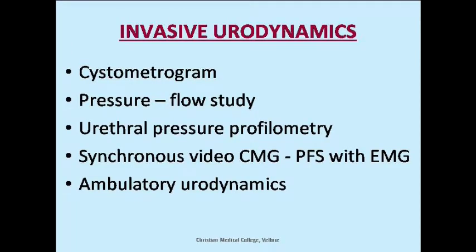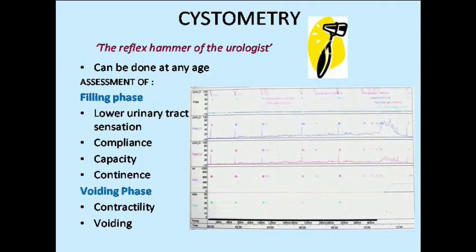And about the invasive urodynamics. The purpose, why do we do them? As alluded to earlier by the speaker, it is basically to figure out the bladder's safety. Now, what is this bladder safety? What is the zone called the safe period?